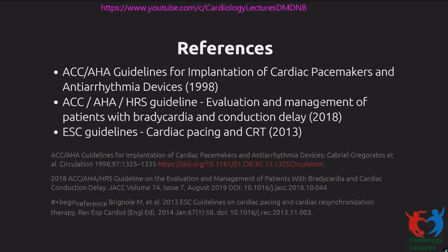DCM, severe LV dysfunction, CHB, underwent VVI pacing, persistent severe LV dysfunction, any point in recommending CRT? The first question is, what should you do at first contact with a patient like this? If a patient comes with a dilated LV and LV dysfunction who has complete heart block, and you can clearly see there is LV dilatation and you're sure it's not due to an acute transient cause, upfront you have to treat them with physiologic pacing. So CRT, or in the current scenario, probably His bundle pacing.